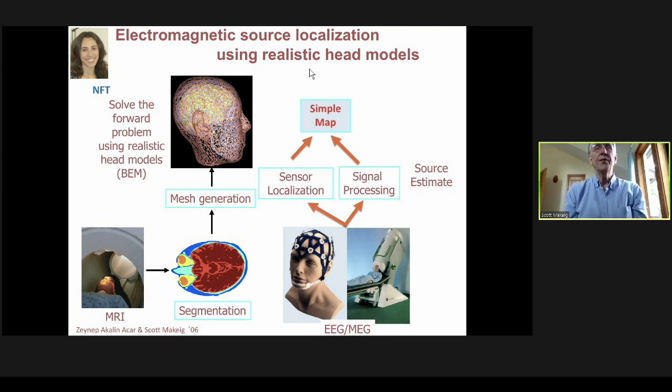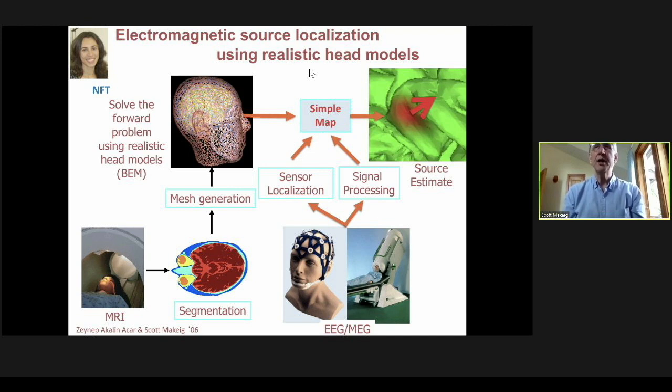And if that map is a simple map, unlike almost any raw EEG map that you could pull out of an hour of recording, if it's a simple map that represents the projection of a single area, such as the effective source we saw in the last animation, then it is possible to solve the inverse problem and estimate, with much less uncertainty than otherwise, the source of the spatially coherent patch, that is the patch in which spatial coherence emerges and produces a large EEG signal.